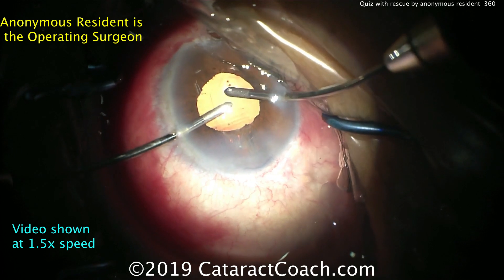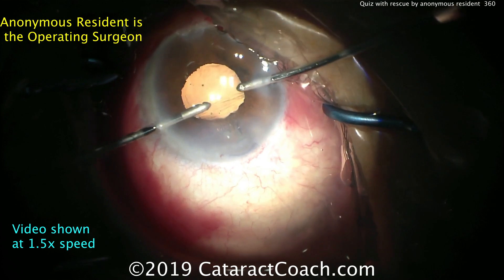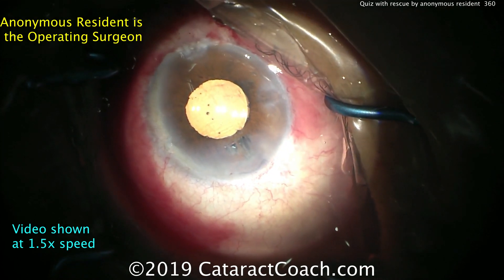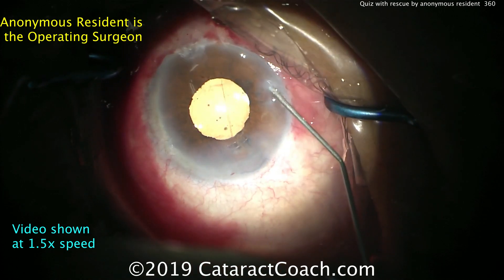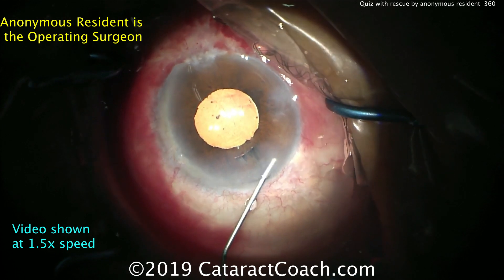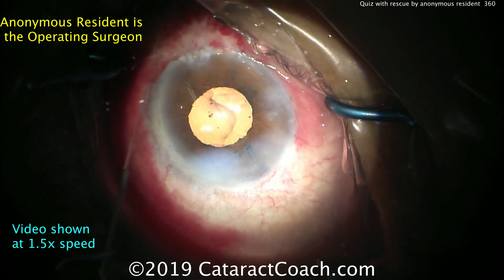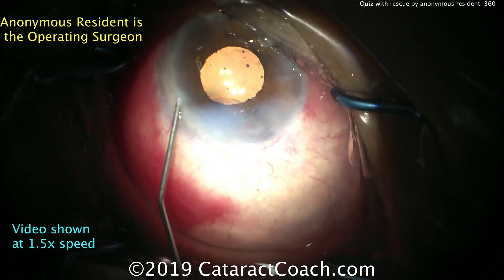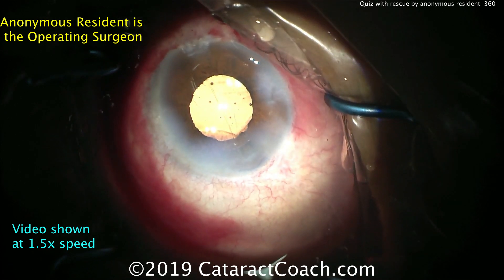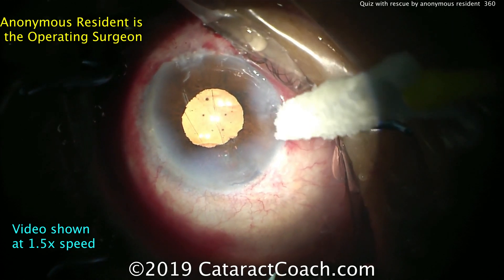Once viscoelastic has been removed, we'll finish up the case. In a complicated case like this, I would prefer a 10-0 nylon suture to seal the main incision — not absolutely required, but it's a little extra measure of safety. Remember, with a ruptured capsule you have an increased risk of complications like CME, endophthalmitis, wound leak, et cetera.